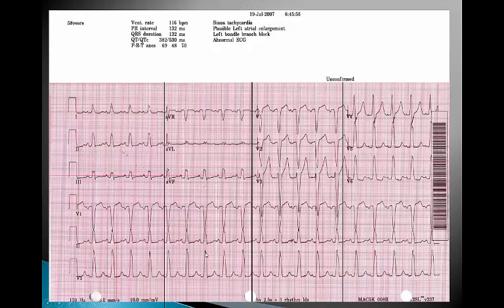So that's a bundle branch block, and basically that means that when you've got ventricular depolarization, where the electrical impulses are going down through the ventricles, they should go at the same rate. Okay? When you've got a bundle branch block, it basically means that somewhere along the line the electrical impulse got stopped and it had to reroute. Okay? And that's what gives you that notched look at the top of the QRS. Okay? People live with them every day, but you know, it could indicate an issue, especially if it's something new. It's something to at least investigate for the patient.